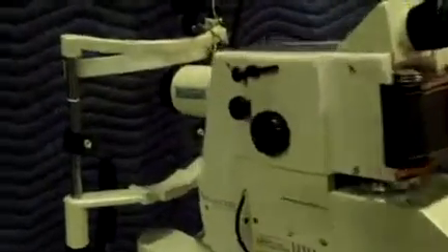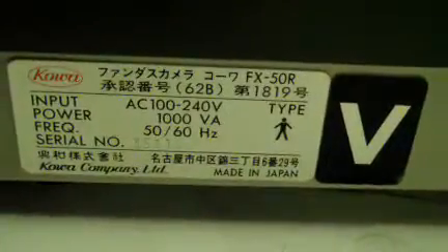Today is July 30th, a Monday morning. We're looking at the Kowa FX-50R fundus camera. Cosmetically, it's in pretty good condition. It does have the camera back with it.